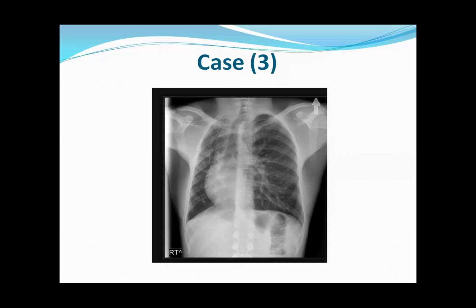Okay, what will you do next? Next, I can do a CT chest for confirming the diagnosis, but I would like to know the history, whether he has had any infections, but this is possibly a congenital pulmonary hypoplasia. Yes, okay. Next.